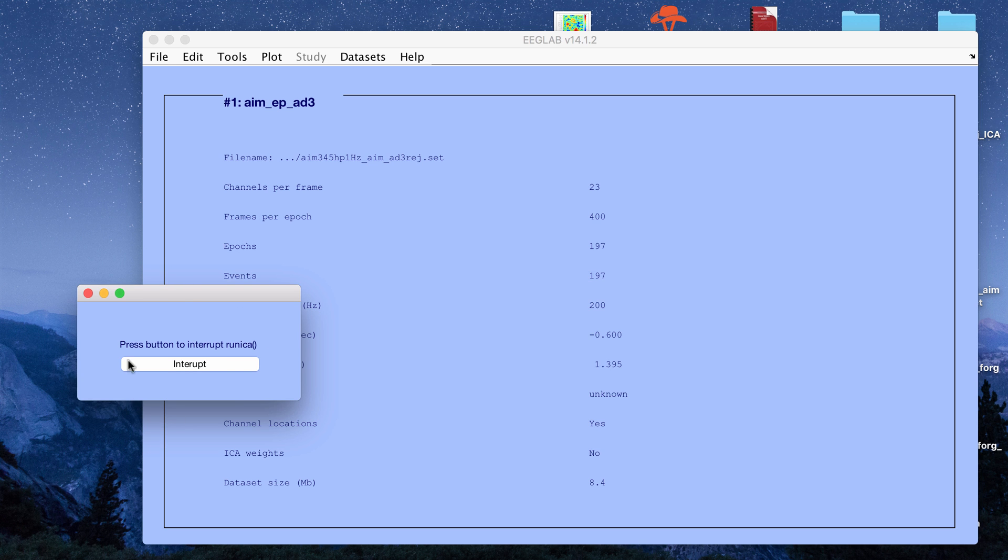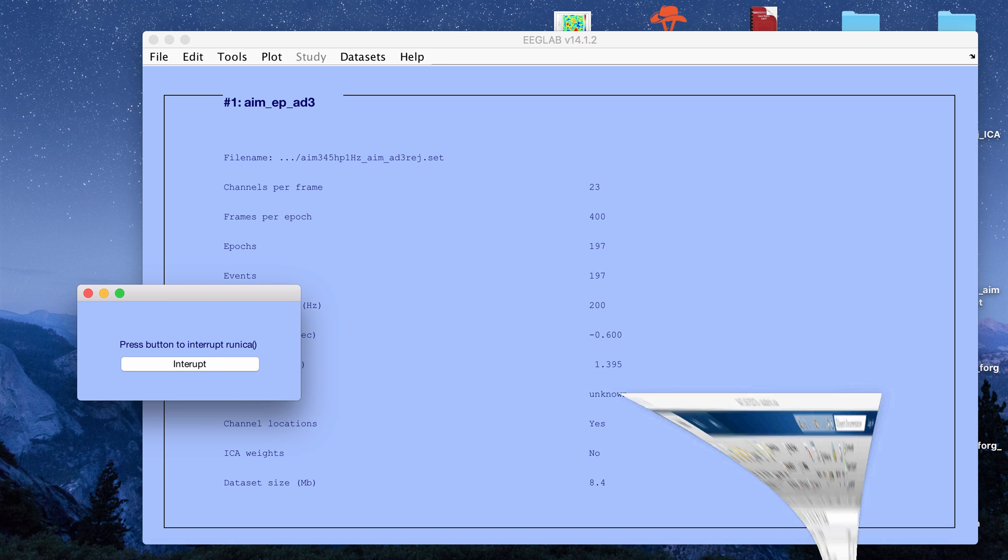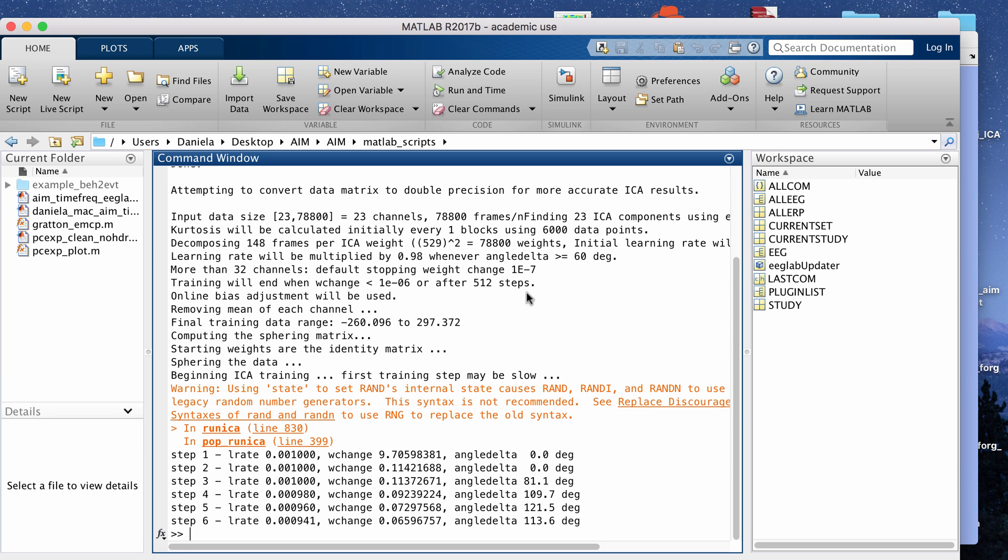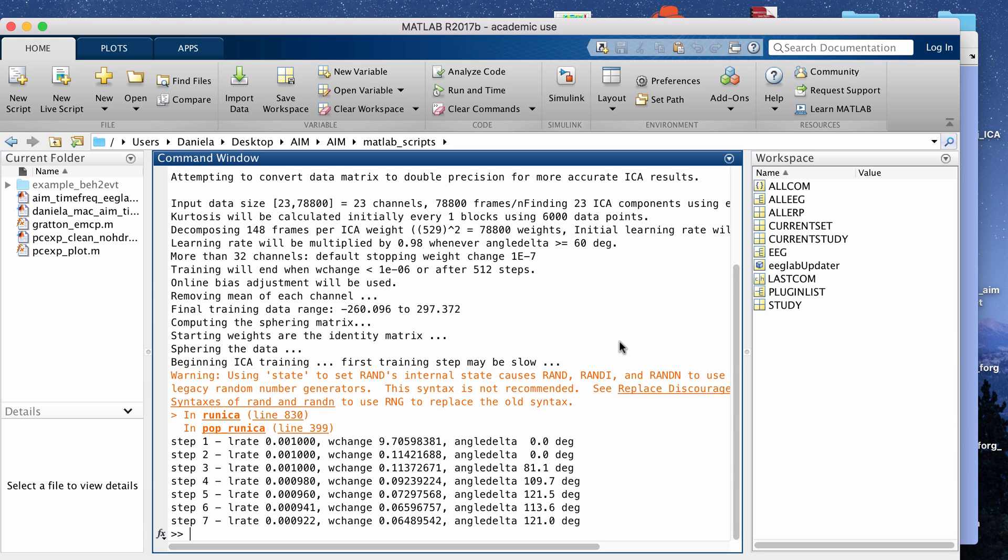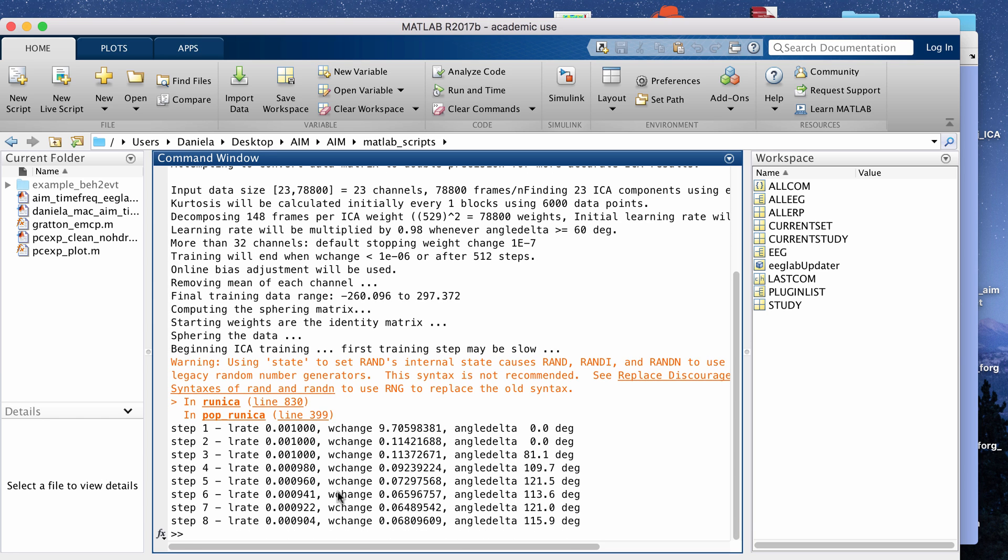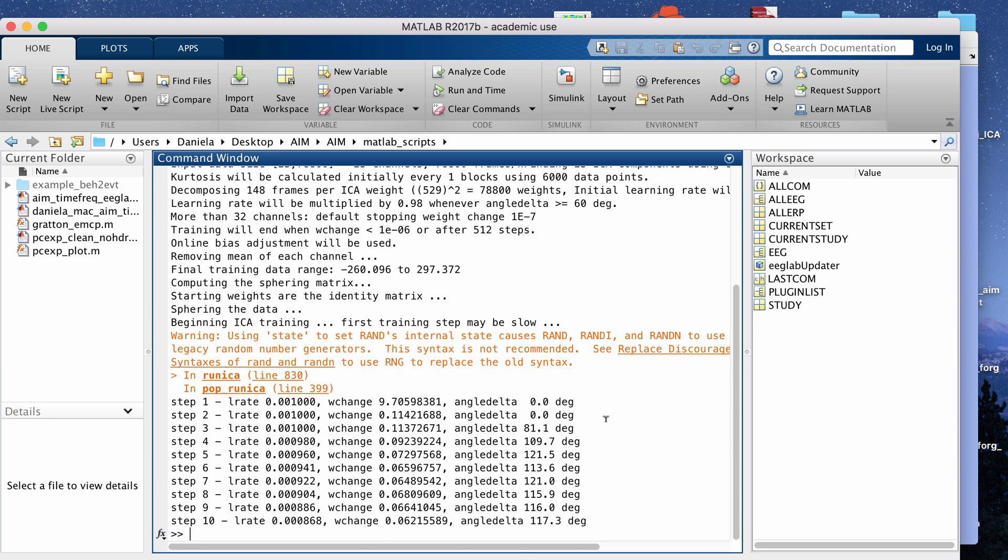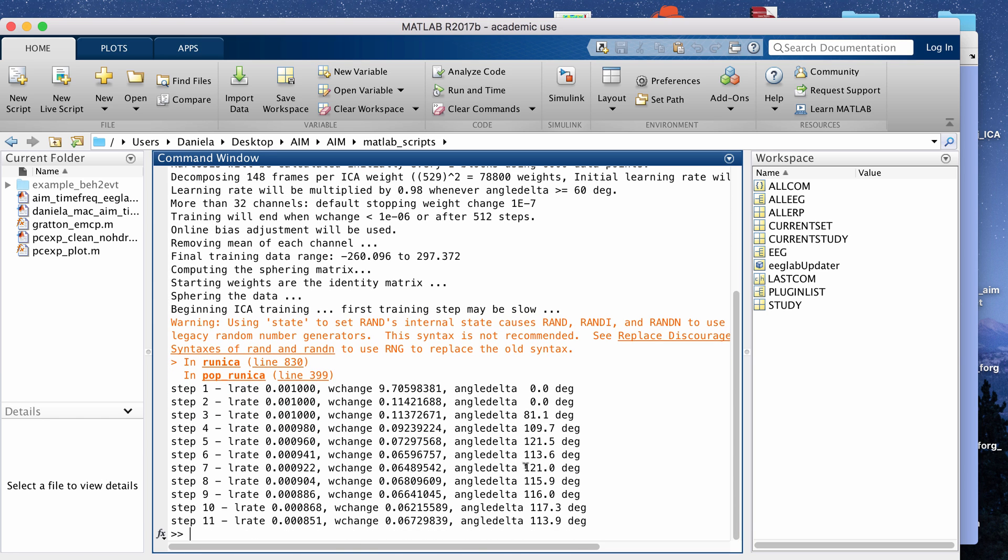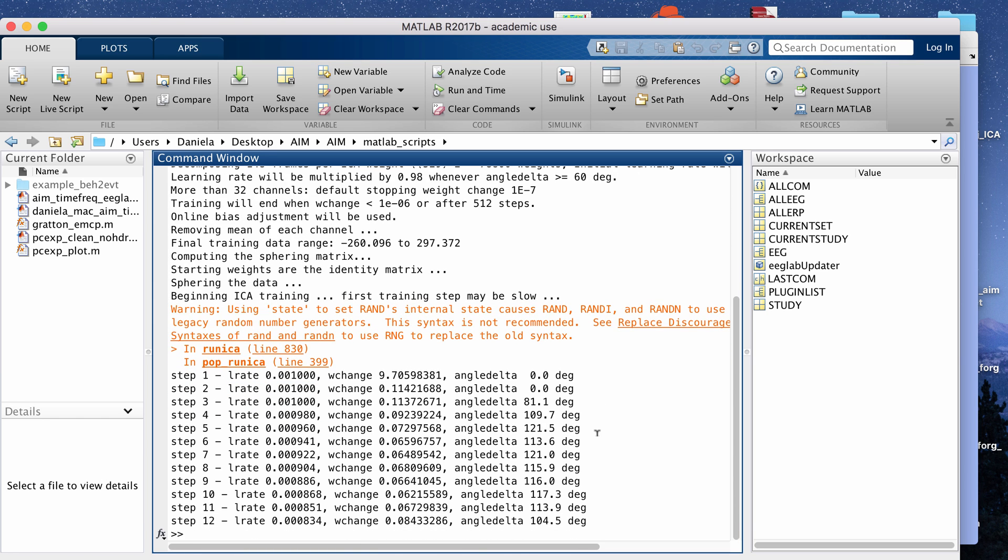Then this little window pops up. This is just if you want to stop MATLAB from running, but if you go to the terminal or command window it will show you that it's working on the ICA.